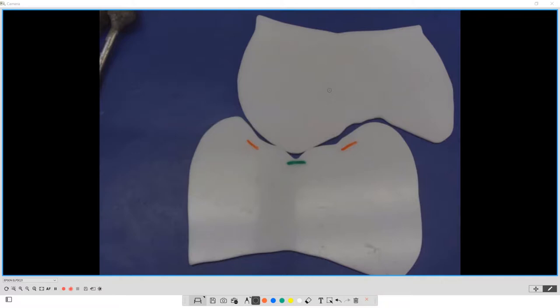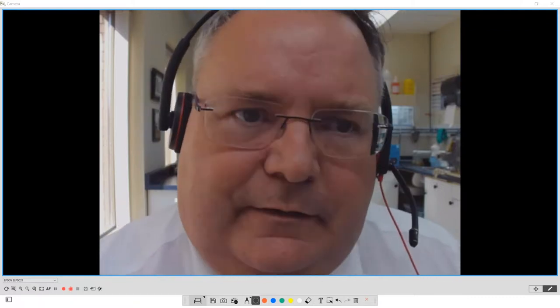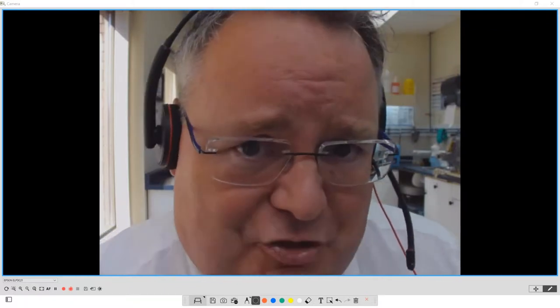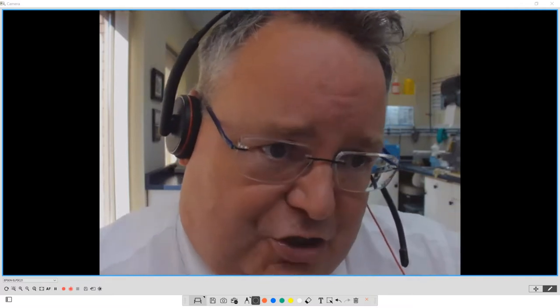that cannot feel their teeth. So early in my career, when I would have a patient and I would say to them, hey, touch your teeth together. Mark, you big dummy, how can they feel their teeth touch? They have no nerve to the denture teeth. So a denture patient feels by the pressure exerted on the ridge.